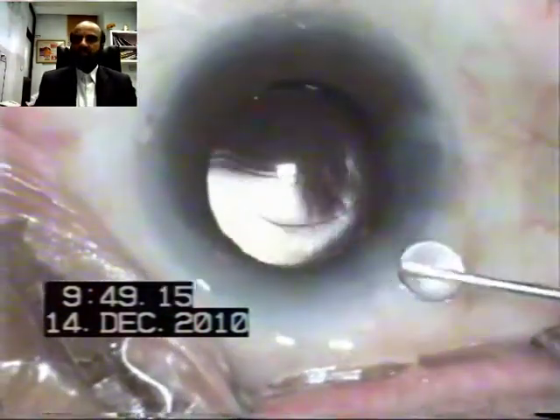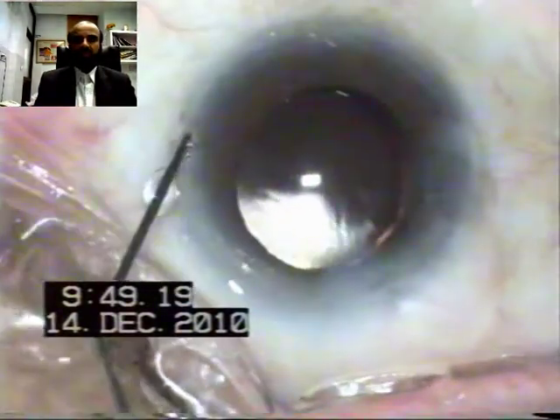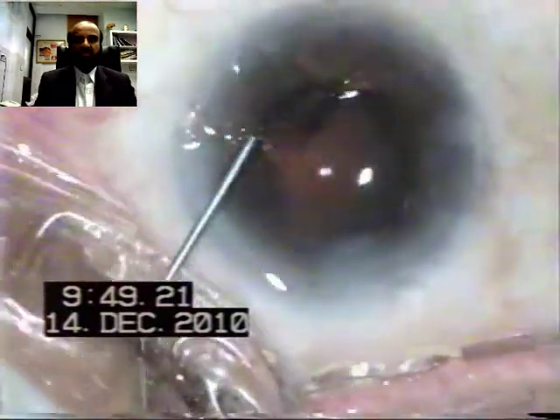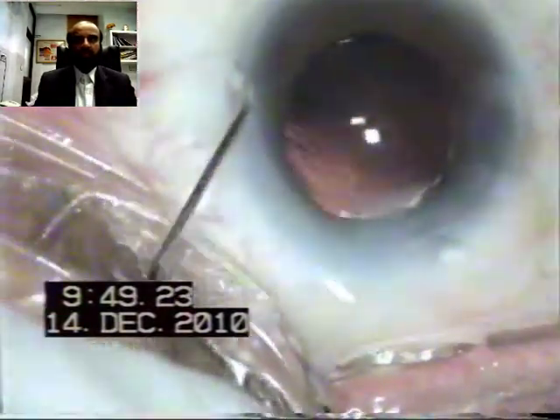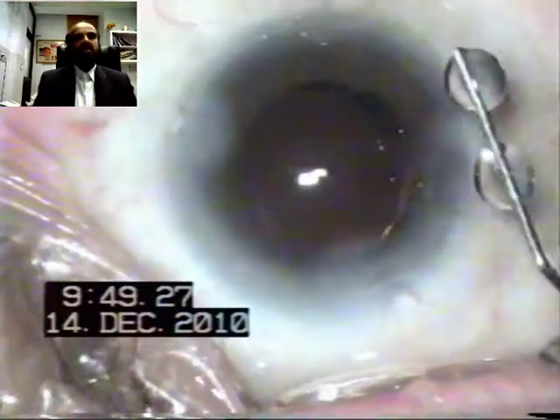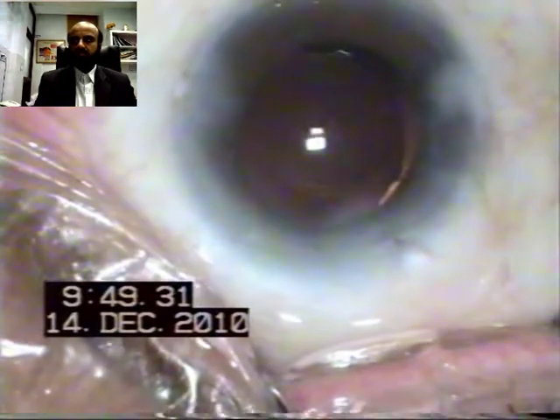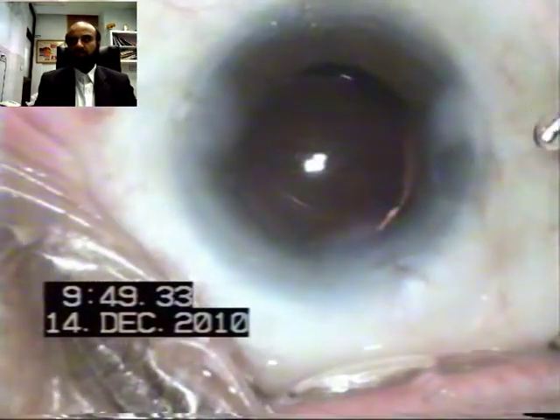Once the posterior capsule polishing and anterior capsular polishing are complete, the viscoelastic is removed. The two paracenteses and the incision are hydrated as usual.